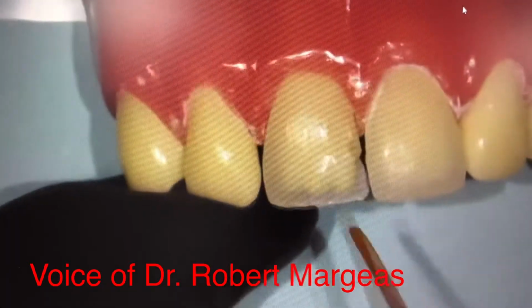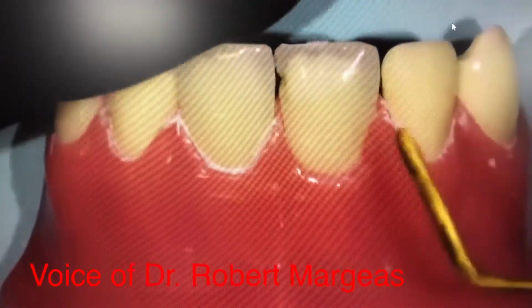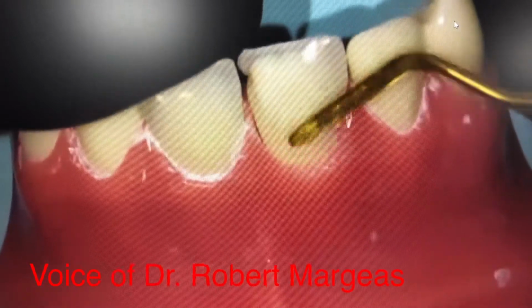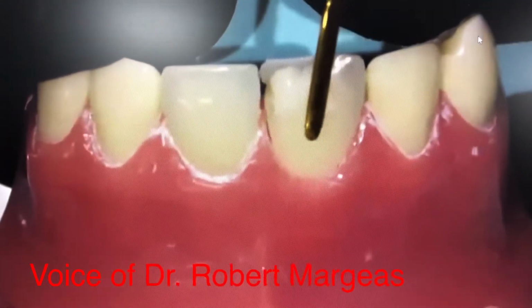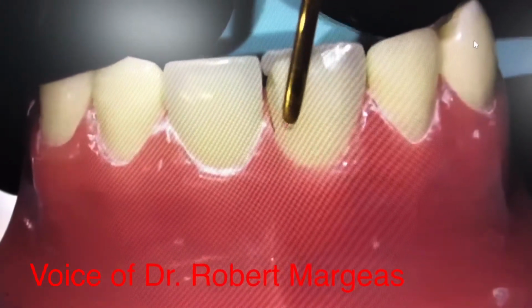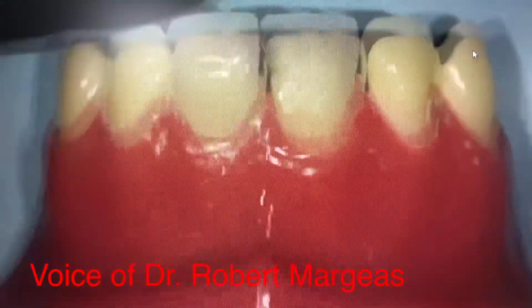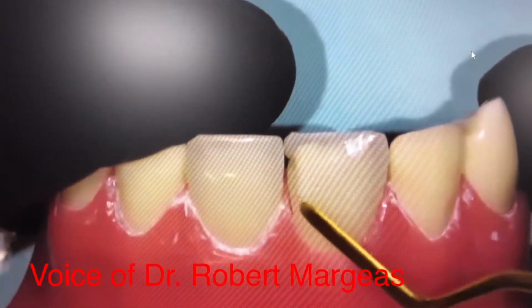But if you see where I added the composite, where you can see that line, that's not good. I have to come back here and blend this into the tooth. You can see that. It's too thick. So what do I do? I smudge this into the tooth to block the fracture, and I keep on blending that in till it really disappears. I want this thin enough so that you don't see any fracture line at all. Blending that in and then thinning it out as I go. Okay? It's blending in. You're starting to see it disappear. Very critical if you have a fracture line.